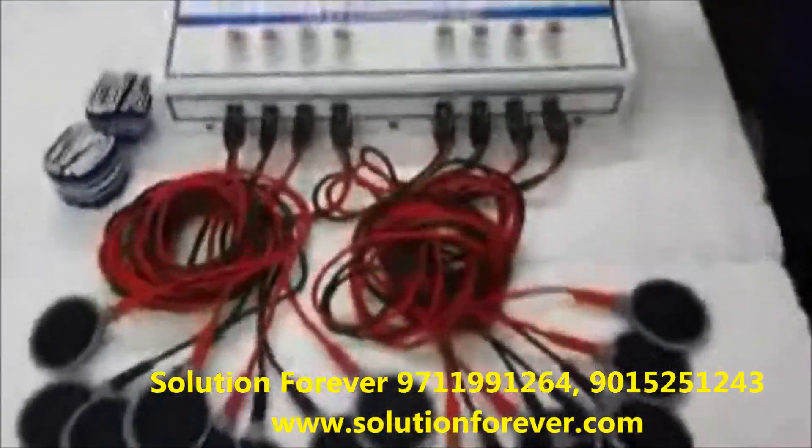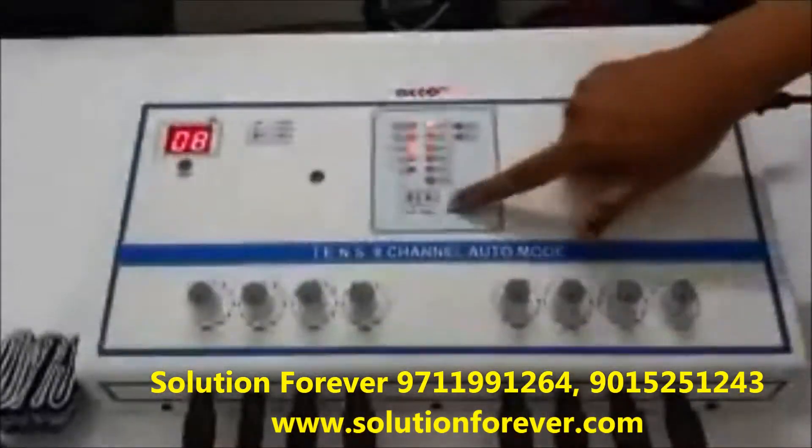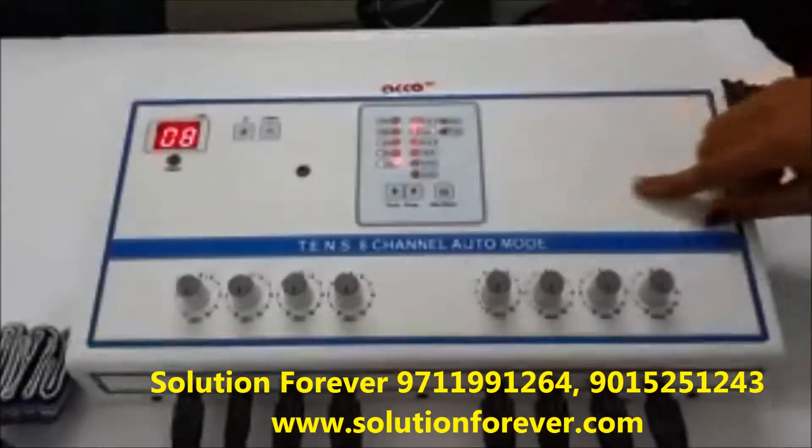Set the timer as per your need — timer up or down. Set the frequency as per your need, and set the program as per your need.